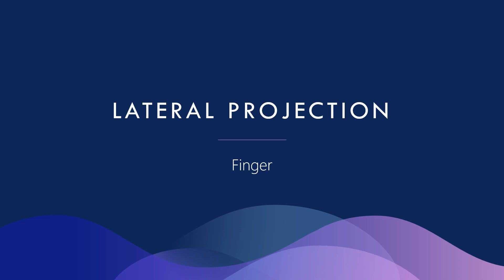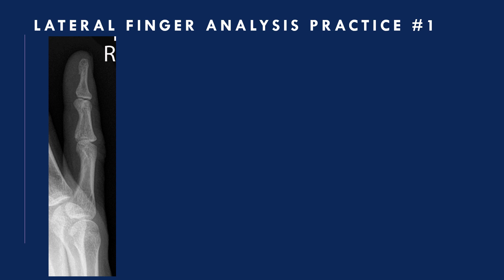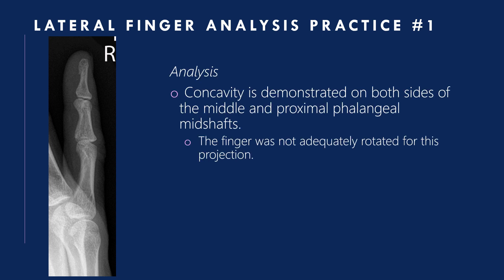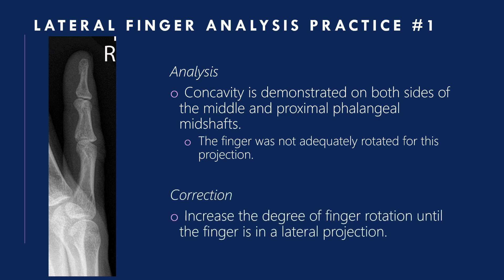Lateral projection of the finger: here are examples of accurate positioning for the lateral projection. Analysis practice one: concavity is demonstrated on both sides of the middle and proximal phalangeal shafts — the finger was not adequately rotated. Correction: increase the degree of finger rotation until the finger is in a true lateral projection.